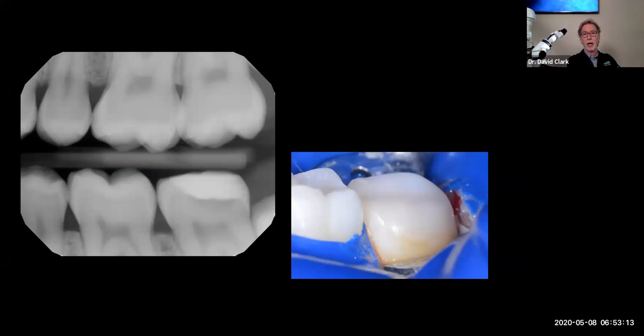So let's stop and talk about what this looks like. And it is a compromise in our eyes for occlusal anatomy. Let me tell you something. This tooth has an immature apex. This patient is 16 years old. We got 1,000,000 miles to go here. And the first intervention is the key. Like Dr. Solomon says, pediatric dentist, the first intervention is the key.